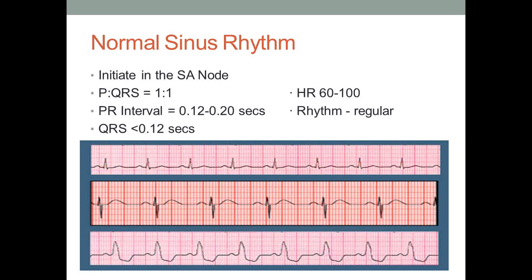ECG interpretation can be very difficult if you don't go through the steps. So I would recommend you take your time, go through every single step, and practice a lot. I'm sure there are resources out there. There are full ECG practice books, and there are a number of resources online. I've created a Kahoot on this, so hopefully that will help you. Just take your time and go through every single step.